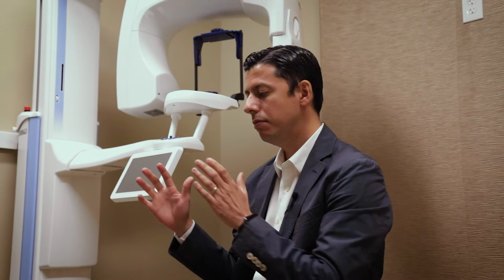So we just published a paper. It's actually a full chapter, and we titled it The Digital Clone. So our vision now is that every patient that comes in receives a CBCT, a cone beam computed tomography, and an intraoral scan. And then we take some portraits. And then we put all these files together, correlating it. I call it making a club sandwich. It's different layers. So the patient can be here for half an hour, consultation, and leave, but we have all the information that we need for the best treatment planning possible.